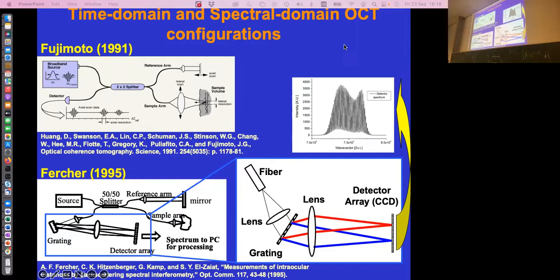This is the maximum, so it's perfectly in phase. What does that mean for the path length difference? It means the difference is a multiple of the wavelength. Yes, so the wavelength fits an integer number of times into the path length difference between sample and reference. So you still don't know exactly the range. No, you don't. We'll get to that.